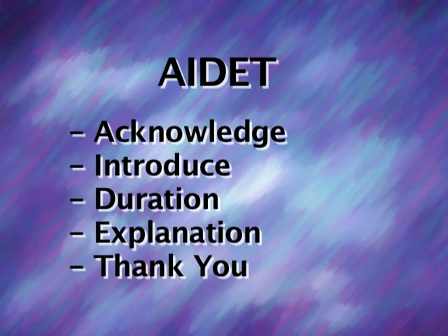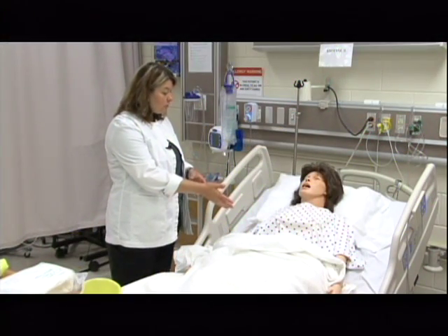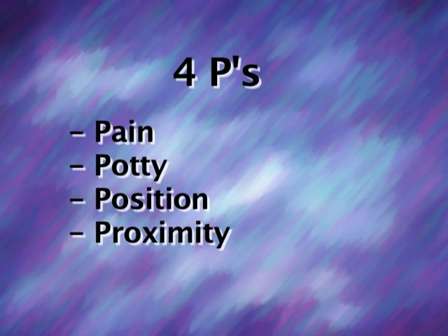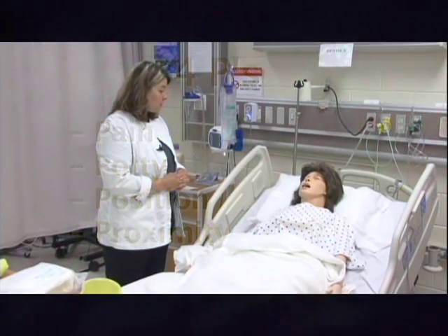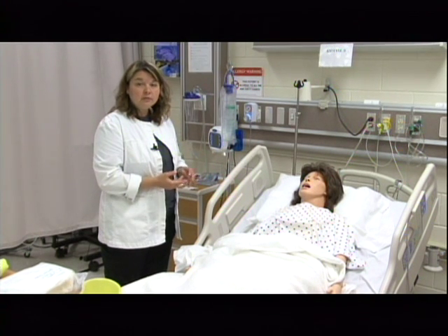Mrs. Smith, I'm going to be in here with you performing an assessment and looking at your tube. I understand that you have a gastric tube down there, and then I also need to give you a tube feeding as ordered by the doctor today. It's probably going to take me about 15 minutes. Do you have any questions? So I've now gone through the duration and the explanation of the procedure.